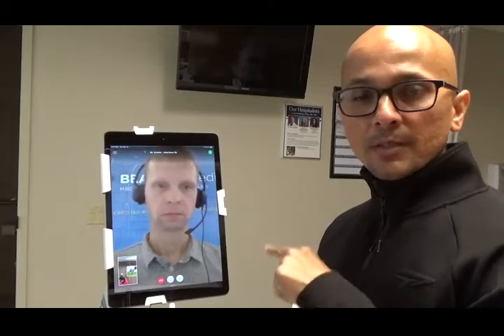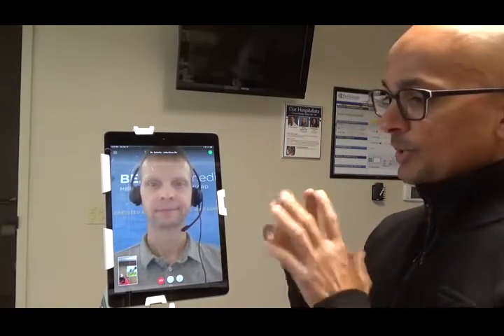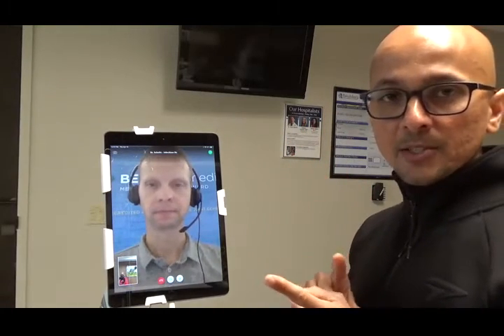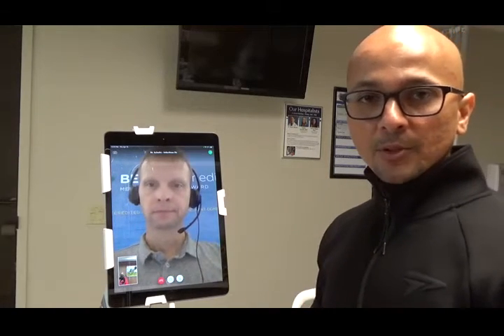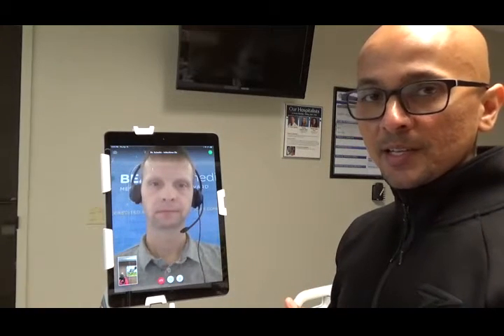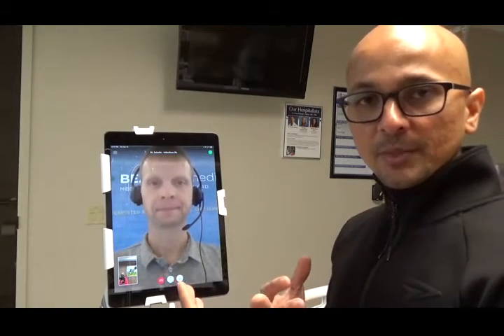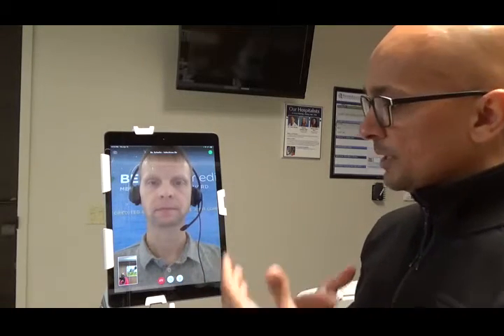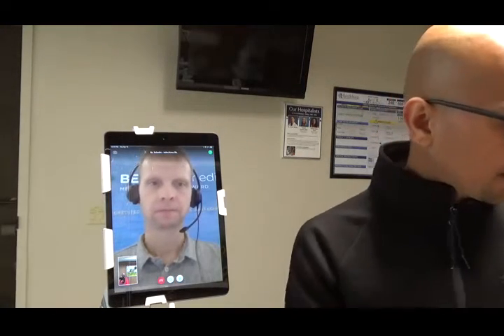Alright, so now we have Dr. Schultz, who has joined the queue, and now he's going to help us from the provider side. And this is for the live exam, like I said, not for the asynchronous store-and-forward part. So the first thing we do for any encounter, just like we've done before, we jump right into the physical exam. The great thing about this is that the physician obviously knows what physical exam they're interested in, so they'll walk the point of care staff members through it. So Dr. Schultz, you want to just let us know what you want, and we'll go from there.